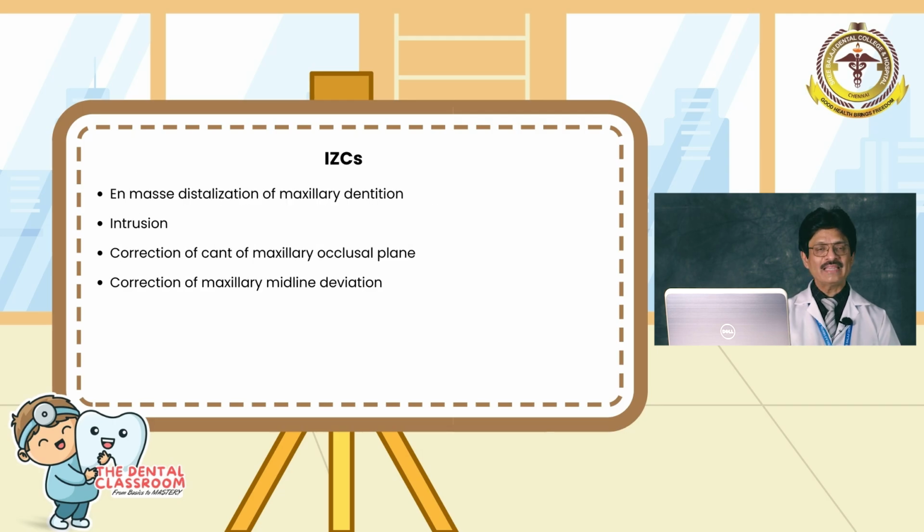So what can these IZCs be used for? En masse distalization of the maxillary dentition, for intrusion, for correction of the cant of the maxillary occlusal plane, as also for the correction of the maxillary midline deviation.